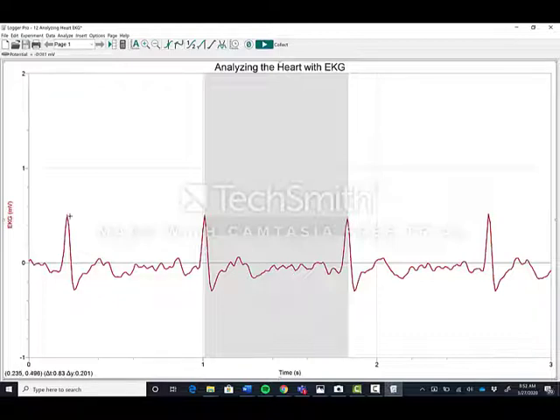So 20 times 4 is 80 beats per minute. The problem with that, just like the caffeine lab, if you did it for extra credit earlier, is that you get fractions of a heartbeat, because the difference between 3 and 4 or 4 and 5 heartbeats multiplied out over 20 times this interval is a lot. You could get 10, 15 extra beats if another R is right about to start here, but we don't count it. That's a significant difference.